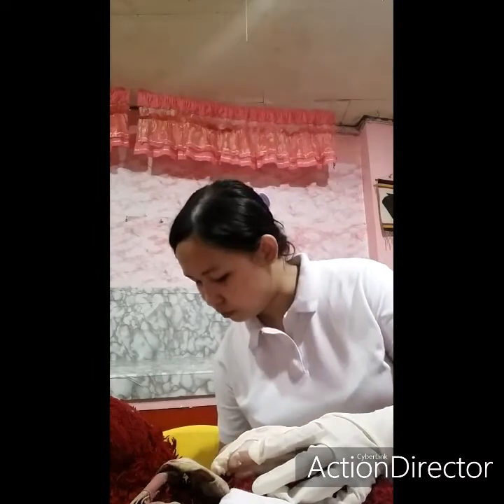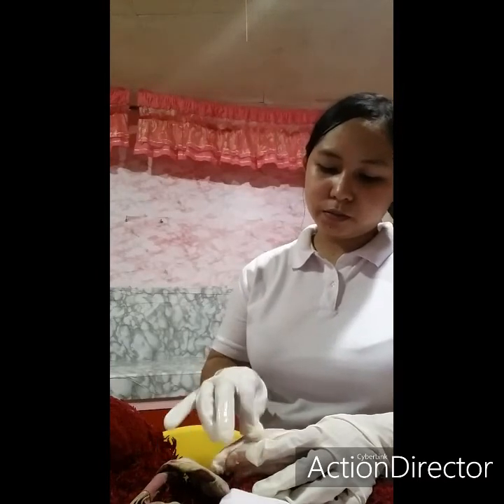In subcutaneous, the site for these injections is the fatty tissue of the upper arm and the thigh. So here, fatty tissue. Pinch. Then, clean the site for injection with cotton and alcohol.